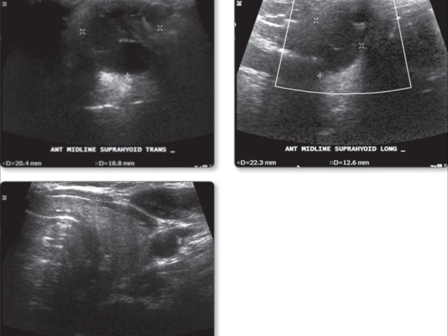The identified abnormality is a complex ovoid mass, predominantly of low reflectivity, measuring up to 22 millimeters in diameter. This mass exhibits posterior acoustic enhancement, a common feature in cystic structures.